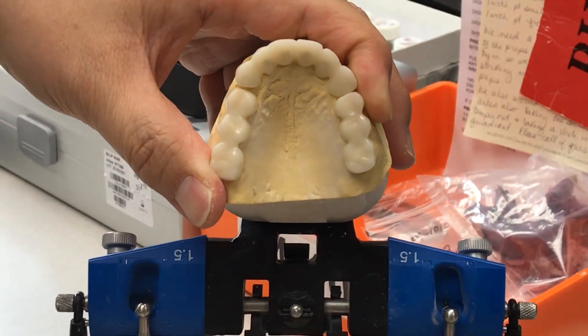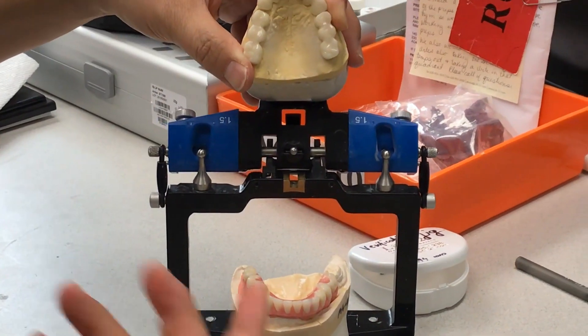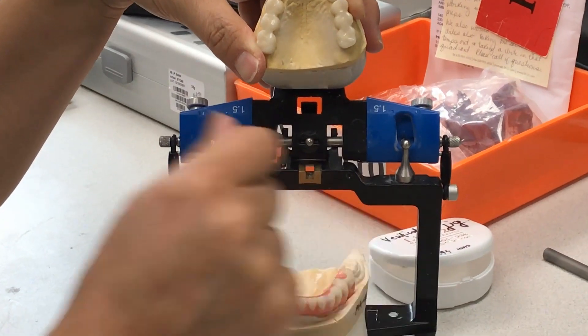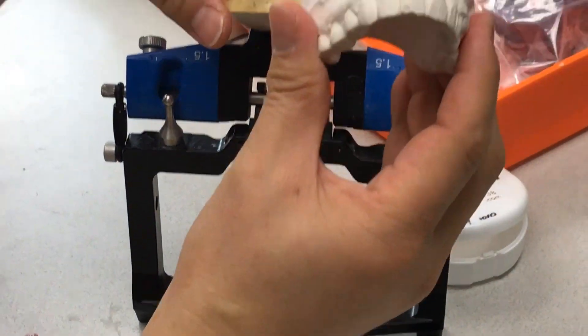Now the doctor's side is very important. Doctor, you're going to screw down number one — that's good. The doctor has this in the patient's mouth.